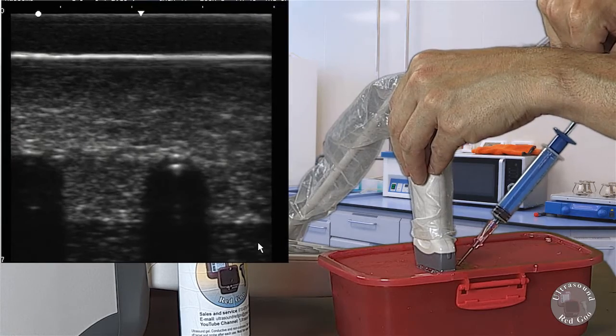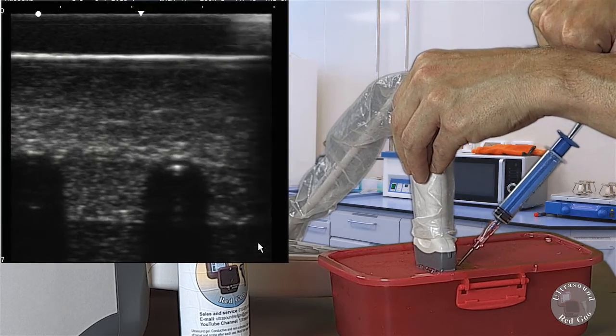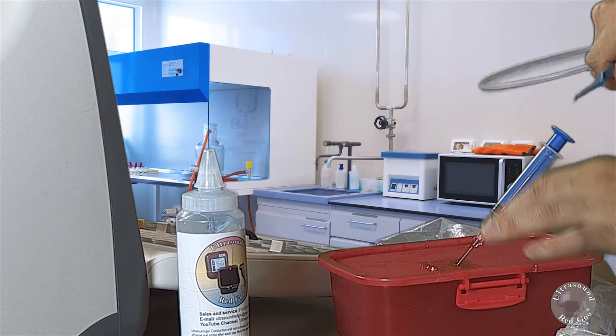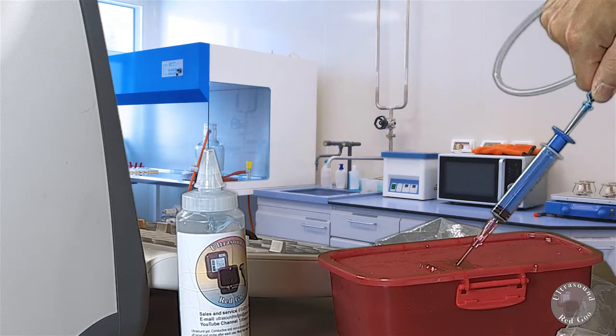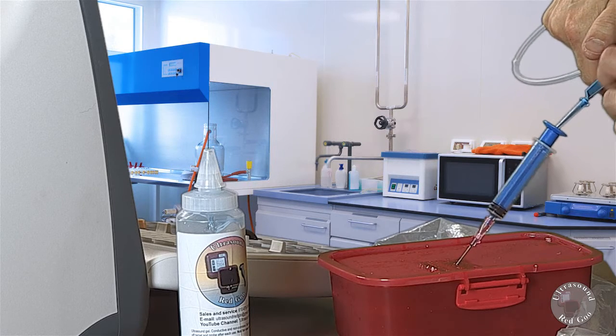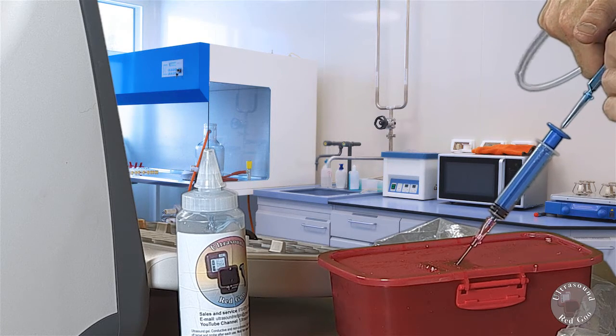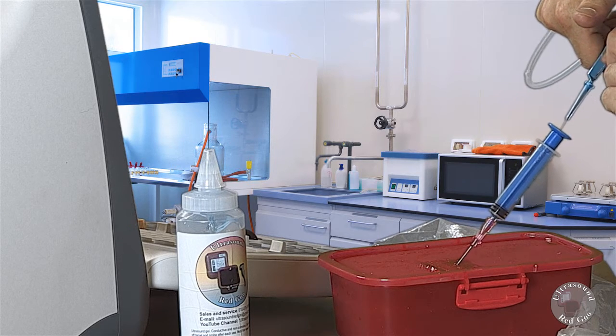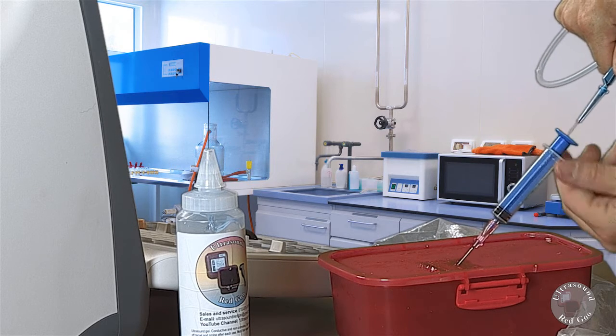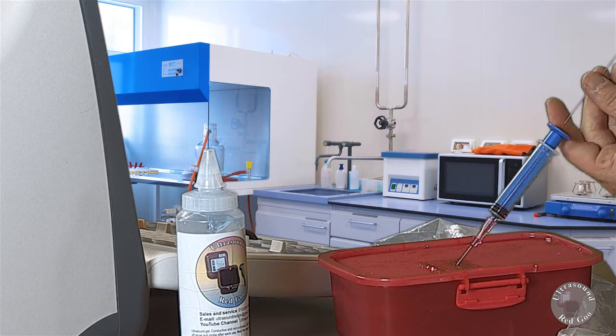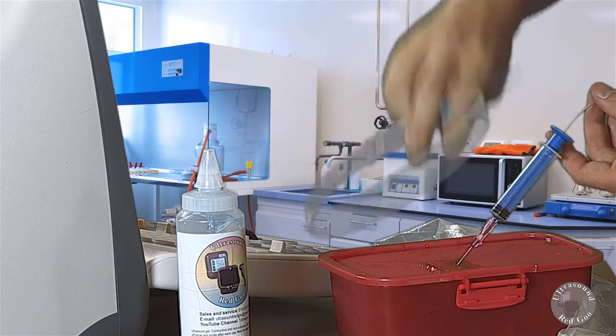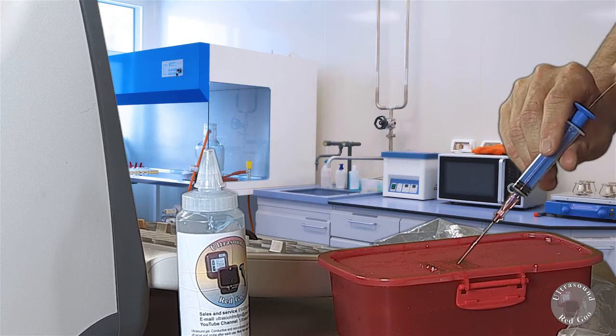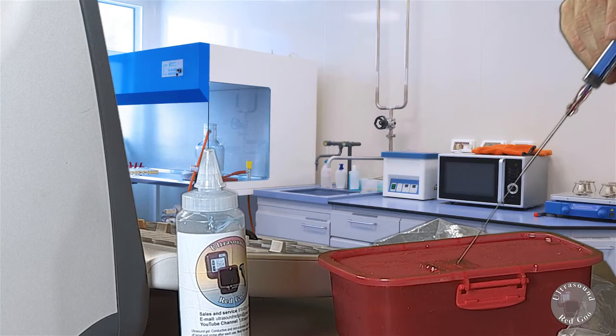So I'm going to go ahead and demonstrate that. I'm going to take my J-wire and I'm going to advance that through. Great, now on block I can go ahead and remove my syringe as well as the needle. And there we go.